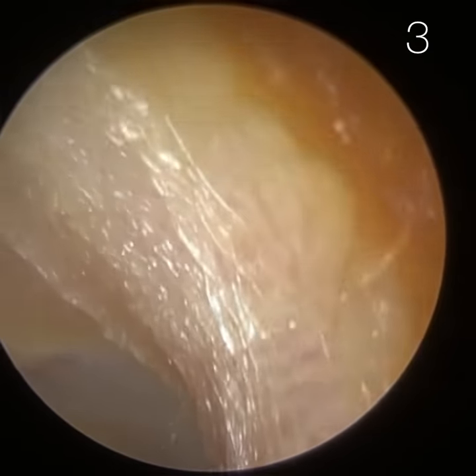This is another patient — their left ear. I remember this ear as soon as I enter it. I'm 100% sure this patient has got a retracted eardrum — we can see the head of the stapes bone. This is a patient who comes every year, and I can recognise their ear straight away. It's always their right ear; their left ear's fine. The reason this patient keeps getting wax and dead skin buildup is because of their retraction. So let me discuss what I mean by retraction.